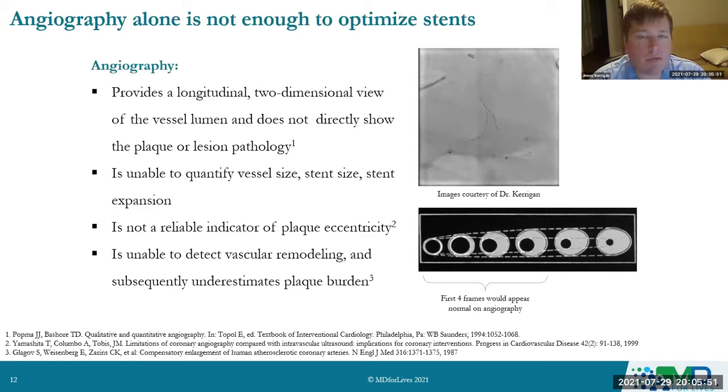I have no idea how thick the wall is. I have no idea most of the time how the plaque is made, which does change the treatment. For heavily calcified plaque, for blockages that are hardened, we don't want to put a stent in and not have it expand without appropriately pre-treating that. And a lot of times, that's not something that's completely apparent on the angiogram.